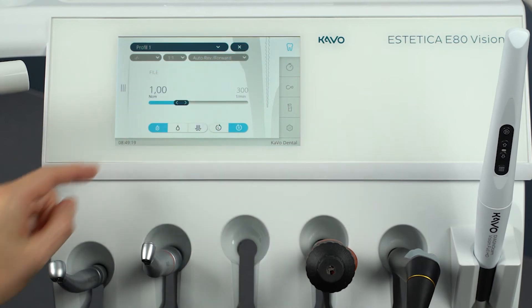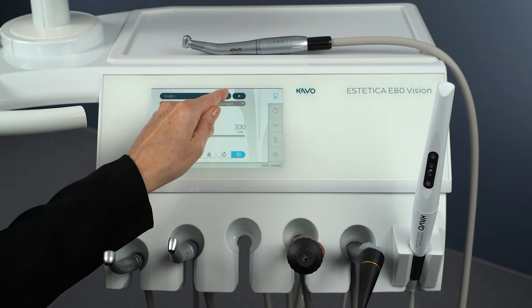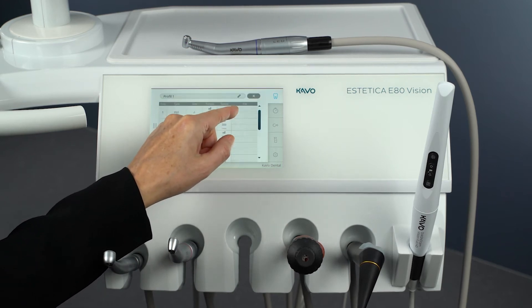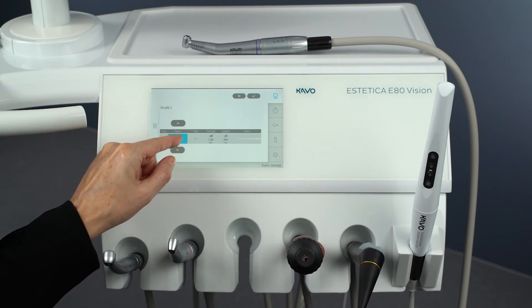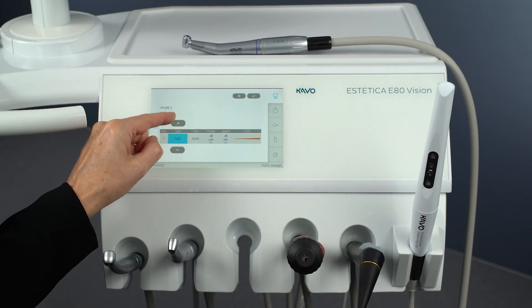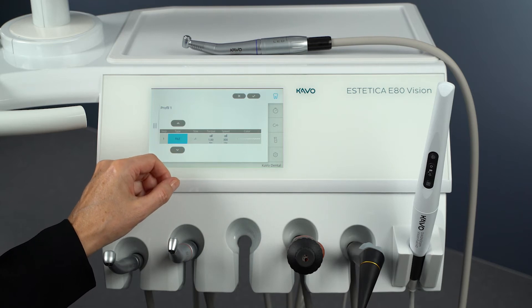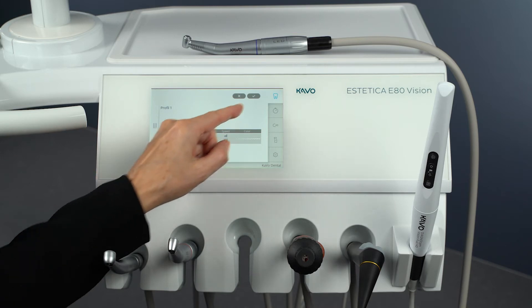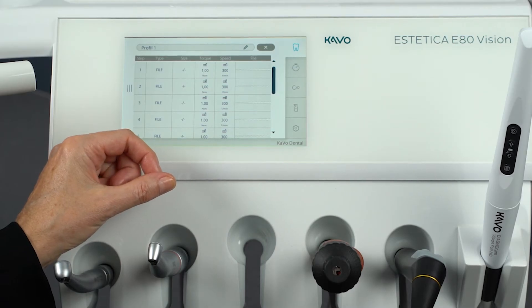The CAVO treatment units with touch display have an integrated file database in the optional Endodontic mode. The current validity of the file data must be regularly compared with the respective manufacturer's information. The values stored by the file manufacturer in the file database are example values, to be compared by the operator with the file data actually used in accordance with the manufacturer's specifications. You can find the list of stored file systems in your CAVO treatment unit's instructions for use.